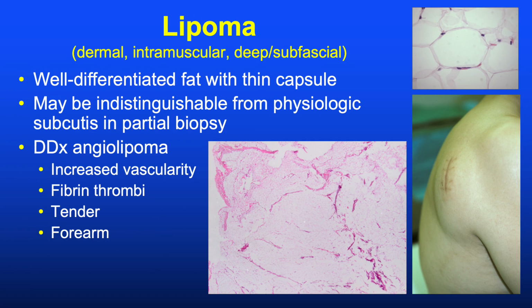Almost as incredibly common and comparably annoying to the skin tag is the lipoma. This image on the lower right was the largest lipoma that I personally removed in my past life as a dermatologic surgeon, but now as a pathologist, I see these multiple times a day, and lipomas are characterized by lobules of well-differentiated fat, typically centered in the subcutis, although they can sometimes be deeper or more superficial, and the individual tumor cells look like fully differentiated adipocytes.